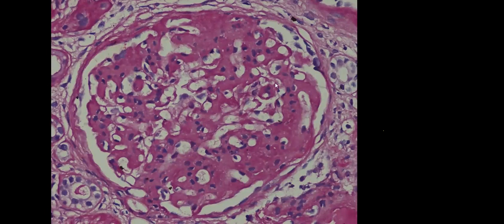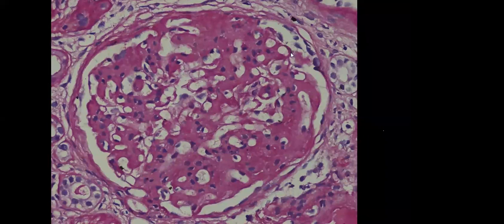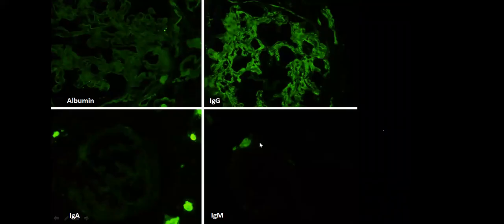And this is a PAS stain. If you look, the membrane is not that thick. Whenever we say the membrane is thick or thin, it is based on the thickness of the tubular basement membrane. So just compare this membrane with the tubular basement membrane, it is similar. But in some areas, the thickening was more. So in this area, it looks thicker than the tubular basement membrane. But if you look at the mesangium, it is PAS positive, and the dominant finding seems to be in the mesangium. It seems that the mesangium is expanded, and possibly there is a segmental sclerosis lesion also.